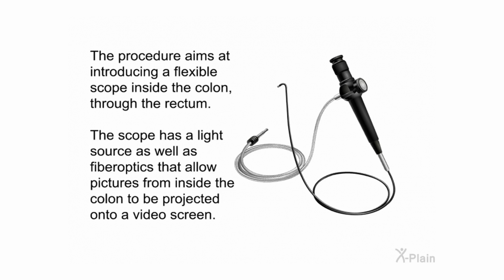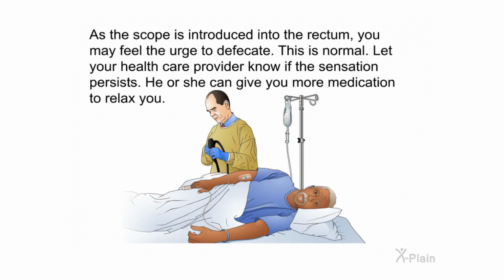The procedure aims at introducing a flexible scope inside the colon through the rectum. The scope has a light source as well as fiber optics that allow pictures from inside the colon to be projected onto a video screen. As the scope is introduced into the rectum, you may feel the urge to defecate. This is normal. Let your healthcare provider know if the sensation persists. He or she can give you more medication to relax you.